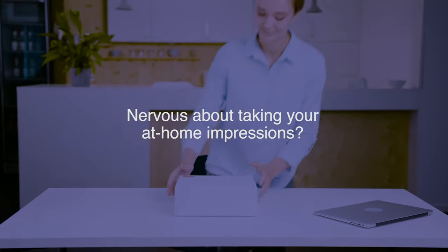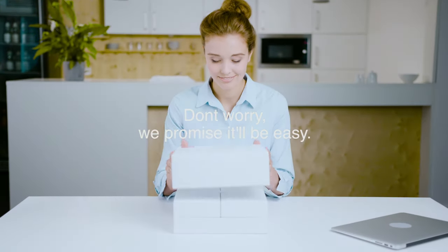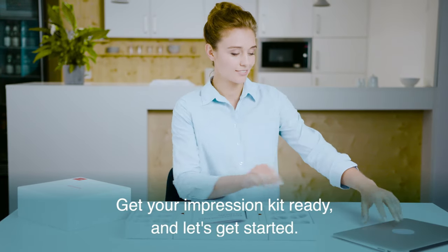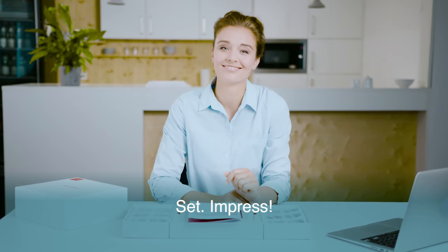Nervous about taking your at-home impressions? Don't worry, we promise it will be easy. And we're here to show you how to make a great impression. So get your impression kit ready and let's get started. Ready, set, impress.